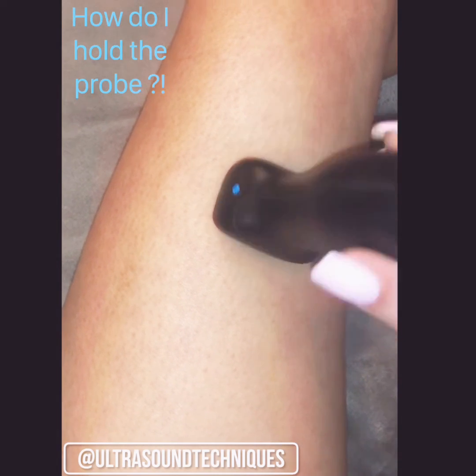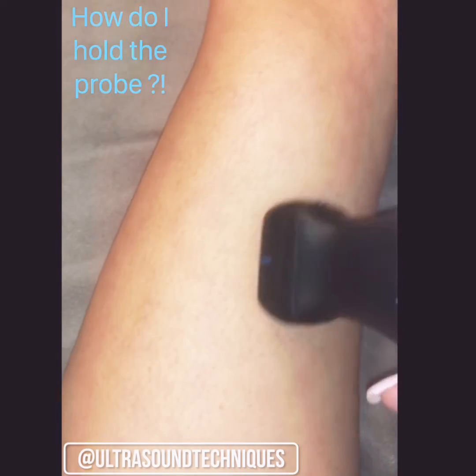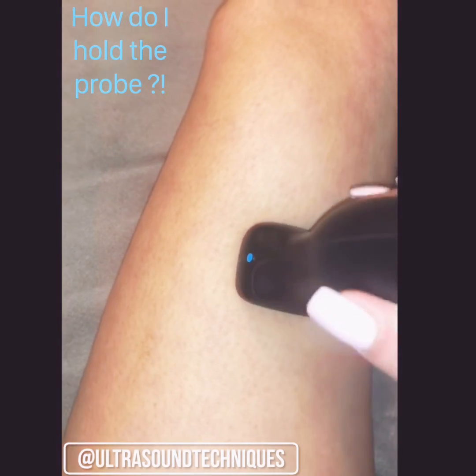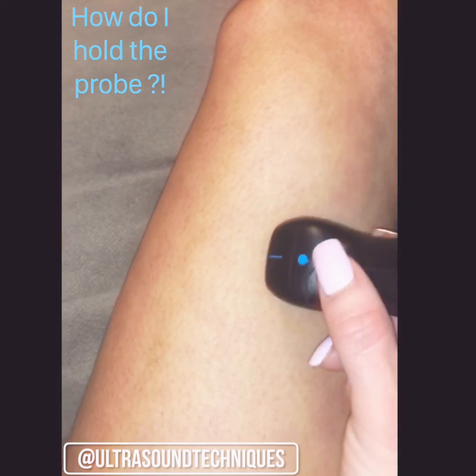How do I hold the ultrasound probe? Am I holding it correctly? Am I going to get the best images one way or another? First off, the one way you have to hold it is to have the indicator facing you.